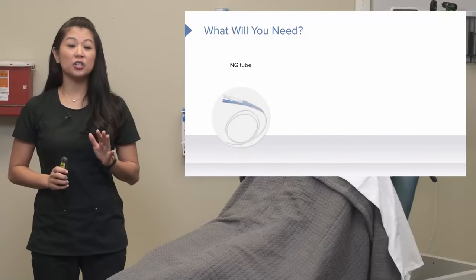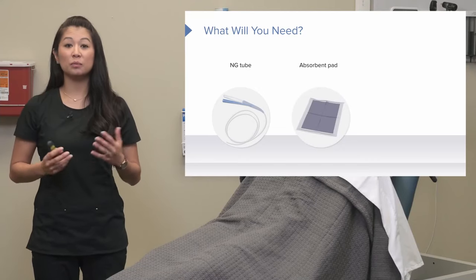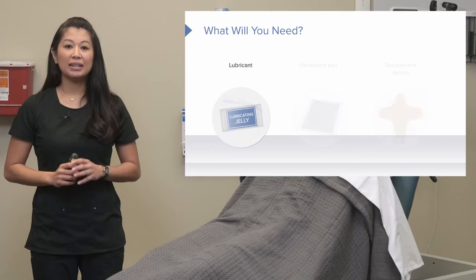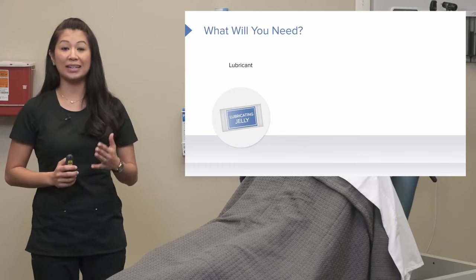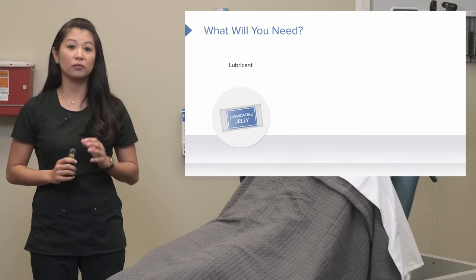You're going to need your nasogastric tube — choose depending on the need for your patient. Here we have a Salem sump, for example. You're going to need an absorbent pad or maybe a towel, and also a securement device. Any time you insert something into a patient, like a Foley catheter or a nasogastric tube, you want to use a water-soluble or lubricating jelly for patient comfort.